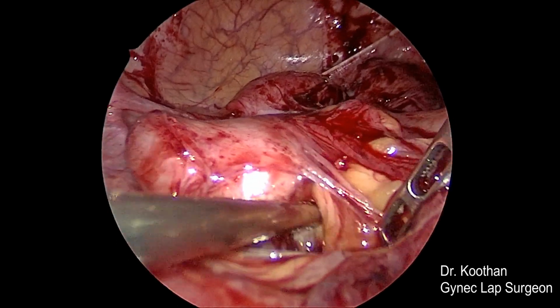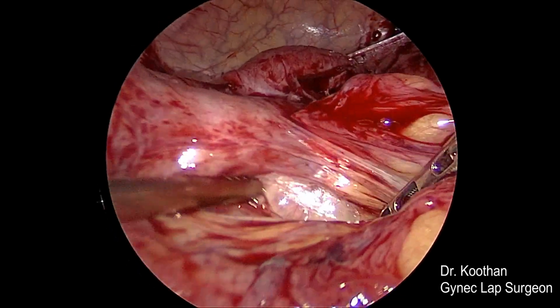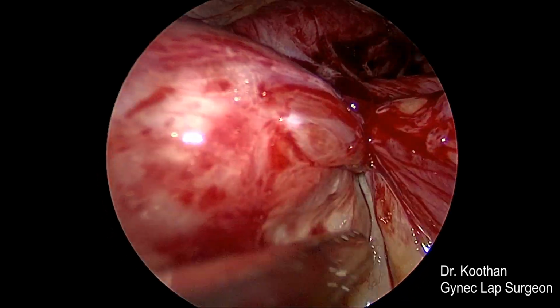Now we are opening the space behind the hydrosalpinx, and what you can see is the space between the rectum and the left side Pyosalpinx. We are dissecting the space between that.